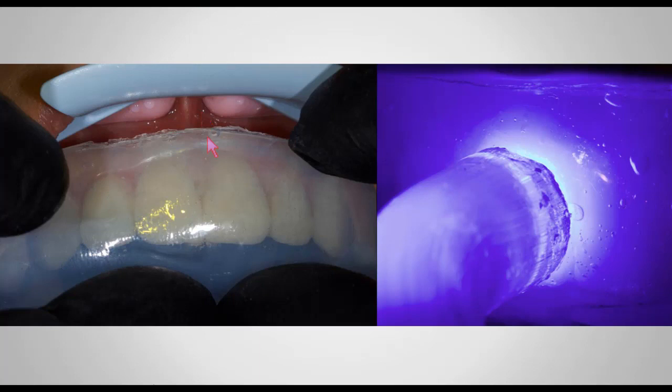consistency or its thickness all around the patient's mouth, based out of the wax up, out of the impression that you made out of your wax up. So everything is going to be determined by that wax up. So you can see here the clear triad is on the outside. The clear PVS is on the inside.